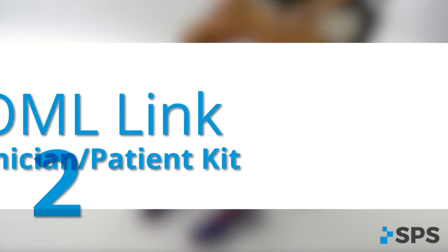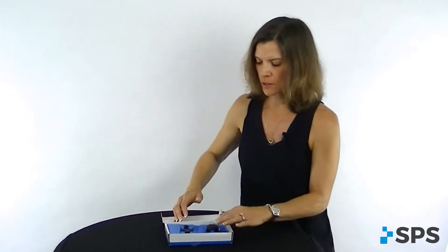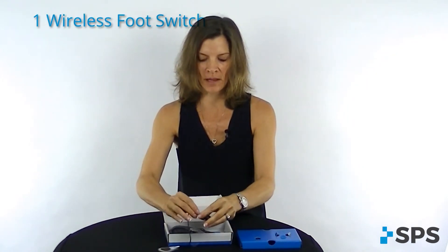The OML link clinician kit and patient kit also have the same contents inside them. When you get the OML link, this is your wireless foot switch. You're going to see that you get the black link — this is your wireless connection between the foot switch and your PaceXL device. You get a little clip that clips on the back; this is what clips on the patient's shoe or they put in their sock or boot. Inside here is the wireless foot switch, and this part is going to connect right to that OML link.